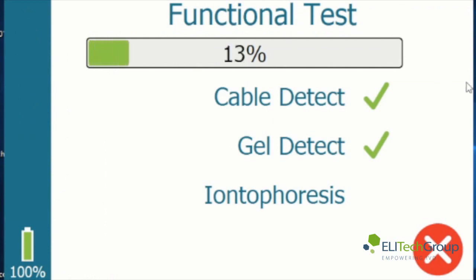You can see that the instrument has already detected that there was a cable connected and that there is a gel placed between the red and black electrode. And now it is testing the iontophoresis system.